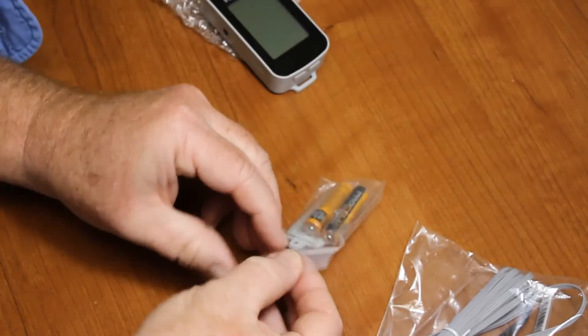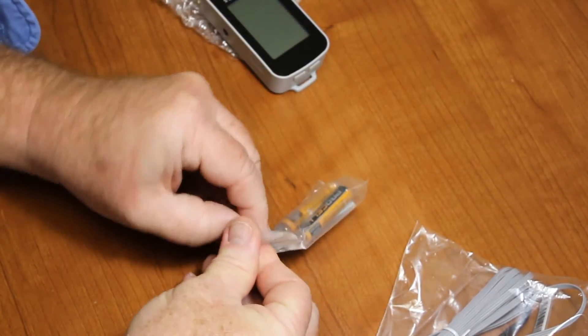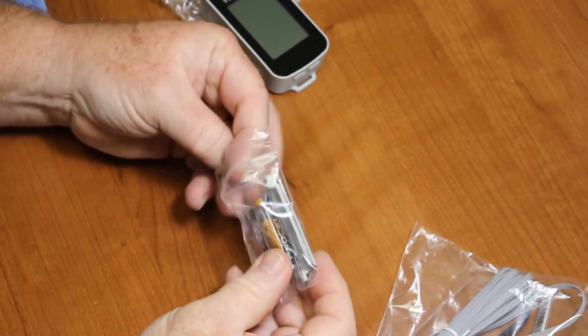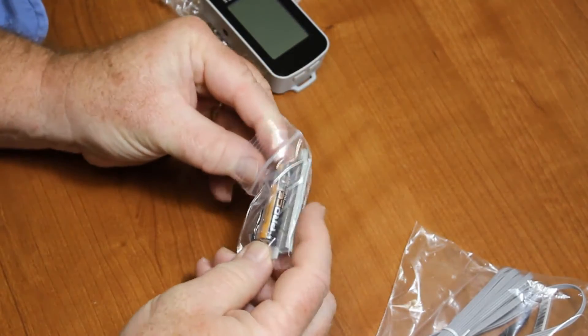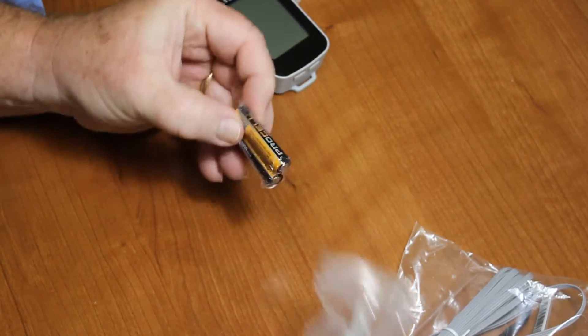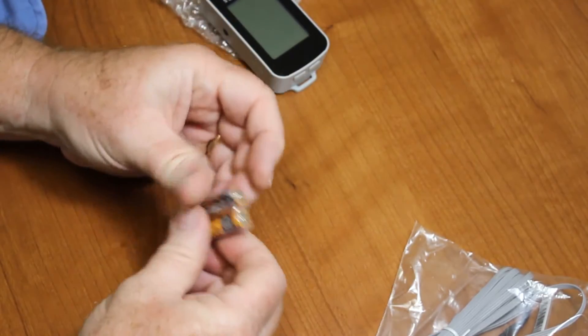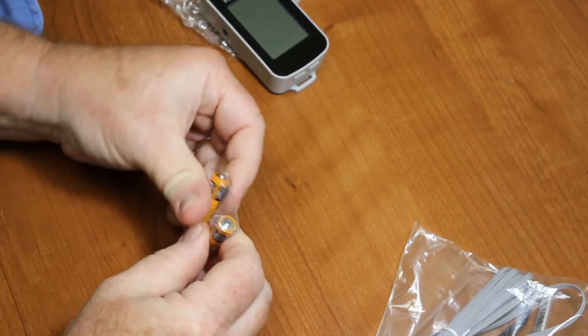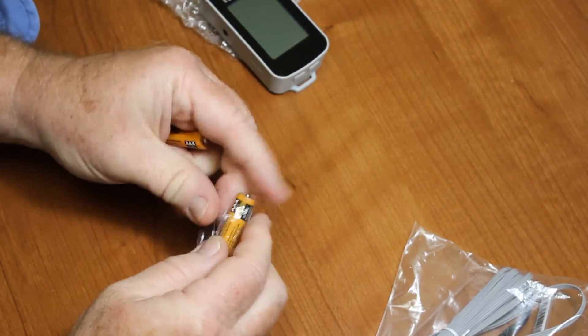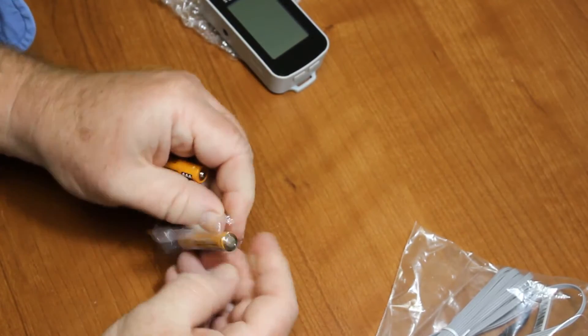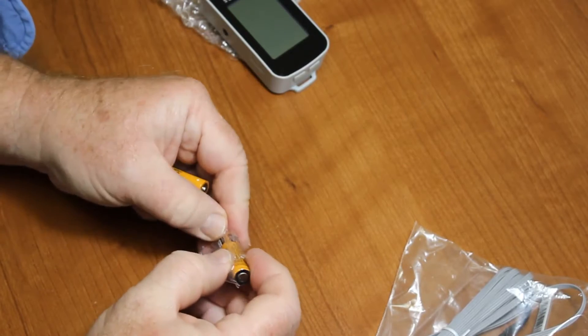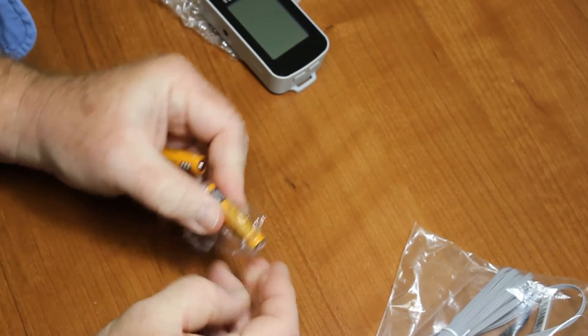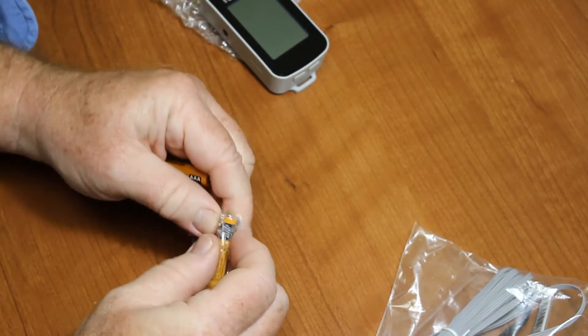The first thing the quick start guide tells us to do is put the batteries in. So here are my batteries. These are standard triple-A alkaline batteries. Open these up, and when we insert them, you have to be careful to put them in.